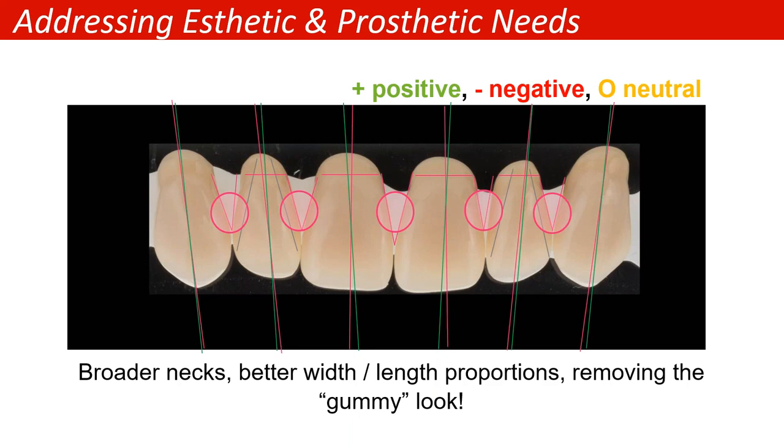So we've broadened those teeth out, we've realigned the angles, and just so everybody knows, when we look at Vita teeth, they are very asymmetrical. So the two centrals on the same card are not going to look identical. They're not proportionally identical. They're not twins. They're different because natural teeth are different. They don't follow unless you've carved them out or you've developed porcelain teeth, laminate veneers, where patients feel like they need to have basically chiclets, very straight incisal edges, things like that. But when it comes to dentures and natural teeth, we have the ability to realign them, to twist them, to create different smiles from the same denture tooth, but make it look different every time we do a setup.